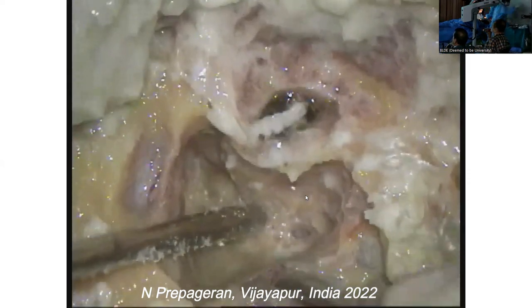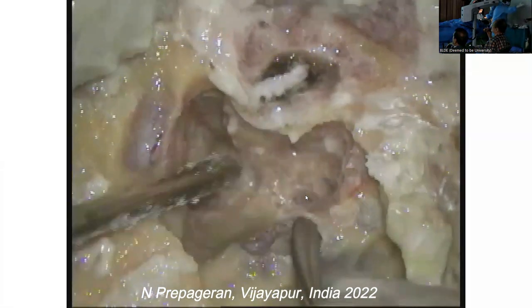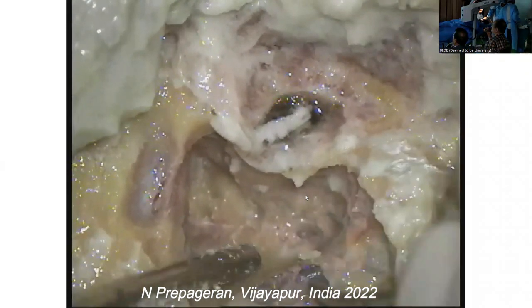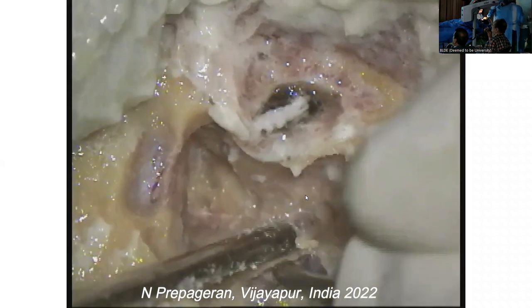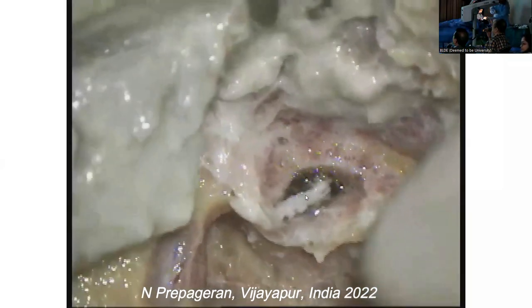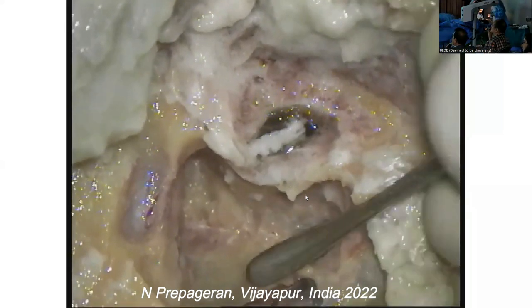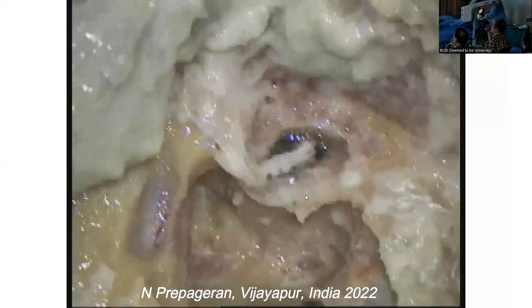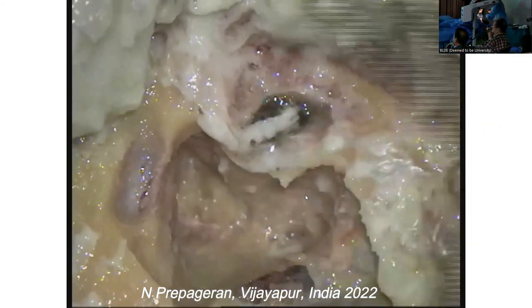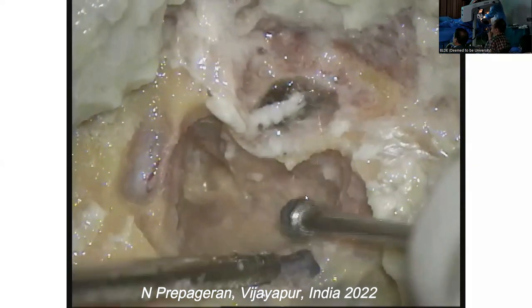Can you see? Once the bone over the sigmoid sinus is down, you can just flick it. Do you have a bone nibbler? There, I'm pushing the sigmoid sinus from its canal. Can you guys see that? Yes, sir. Can you hold on to this? Once you do that, then you are able to drill. Once you do this, you can push the sigmoid sinus down.